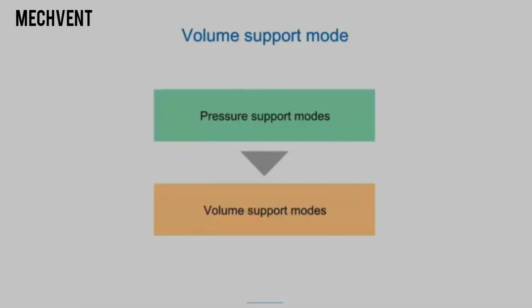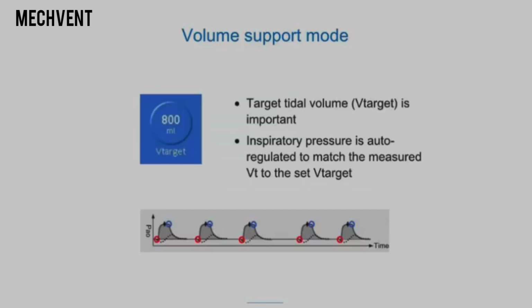Volume support mode. The volume support mode is derived from the pressure support mode, and is relatively young. Its clinical benefits and limitations are not yet fully known. Target volume is a critical control of volume support mode.